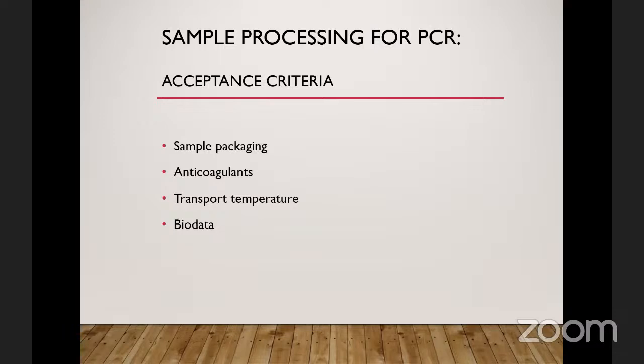So the universal bottle they used to transport one sample before, they now put the other new sample inside it. They recycle it and put another fresh sample inside it, and it's coming to the lab, and you are not careful enough. You just write the name on the outside, not knowing that the name inside the original sample bottle is a different name. So biodata and getting patient information is very key in accepting sample into the laboratory. Next slide, please.